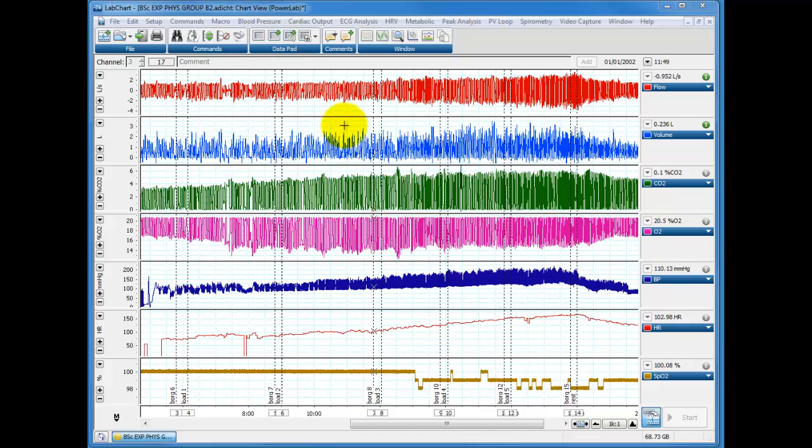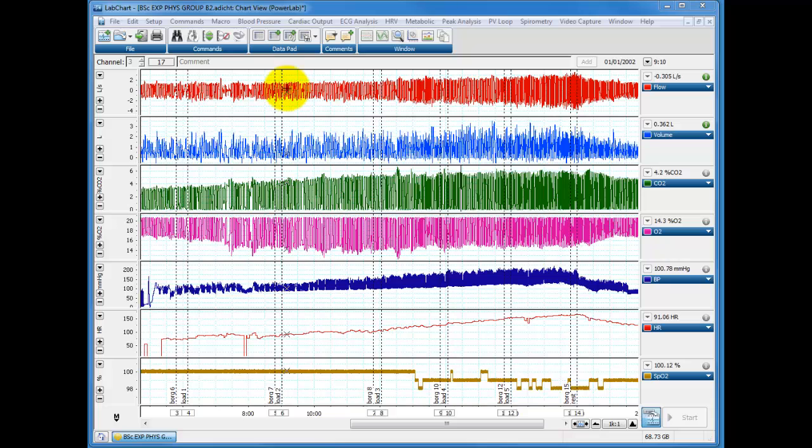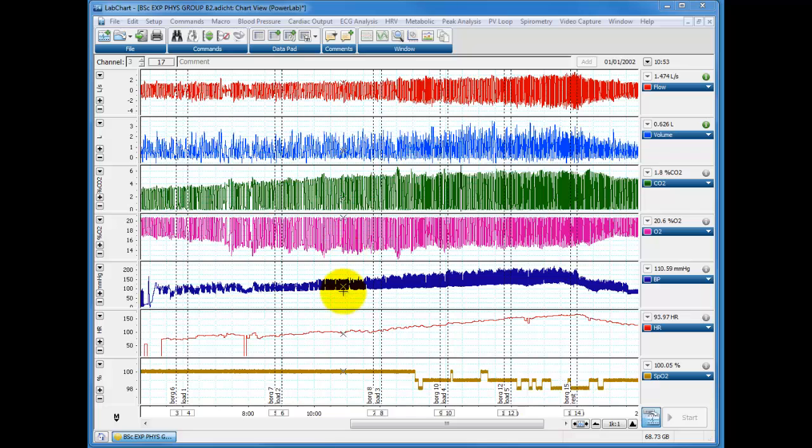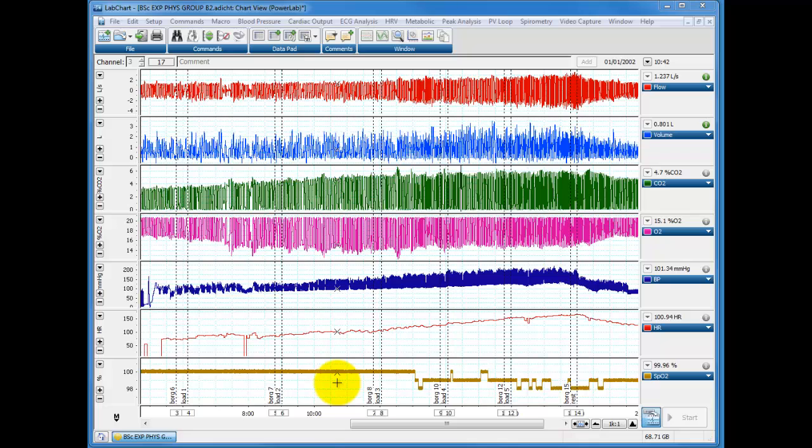Here we have the incremental exercise protocol we've been using for other analyses. We've got flow, volume from the respiratory pod, we've got CO2 and O2 from a Servomex, blood pressure, heart rate and SpO2 from Finopress, ECG and SATs meter respectively.